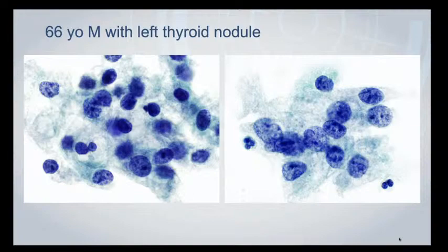For those of you who see a good number of renal FNAs, I think you'll probably recognize this as a fairly typical appearance of a clear cell renal cell carcinoma. So this is a metastasis from a renal cell carcinoma. Now you may have that history, which would certainly help you. You may not. Sometimes the nephrectomy has happened quite a number of years ago. People have forgotten about it.